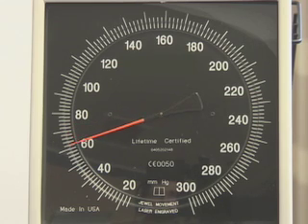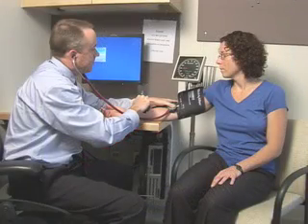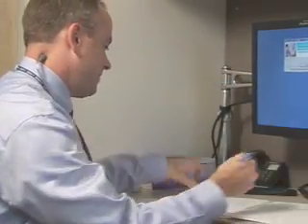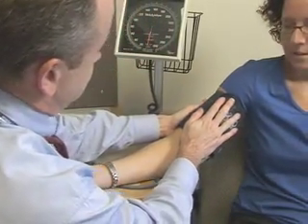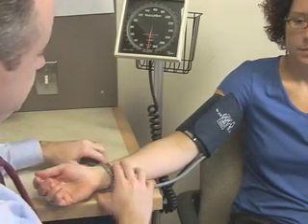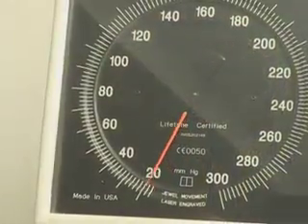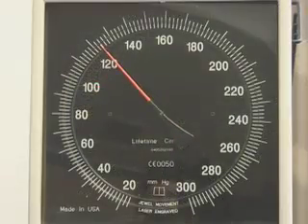To ensure that diastole has been reached, the cuff pressure should continue to be deflated for an additional 10 millimeters of mercury beyond the 5th Korotkoff sound. You should measure the blood pressure twice at a minimum, waiting at least one minute between readings. The average of the measurements should be recorded. In the following example, the patient's blood pressure is 116 over 90 millimeters of mercury. You will hear nothing until the first Korotkoff sound appears at 116 millimeters of mercury. The various phases of Korotkoff sounds will be heard until their disappearance at 90 millimeters of mercury.